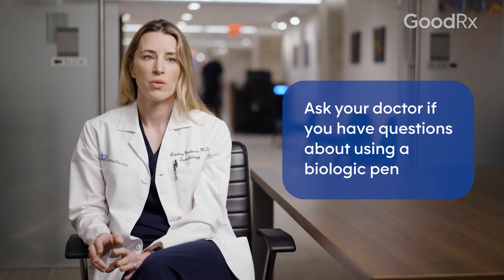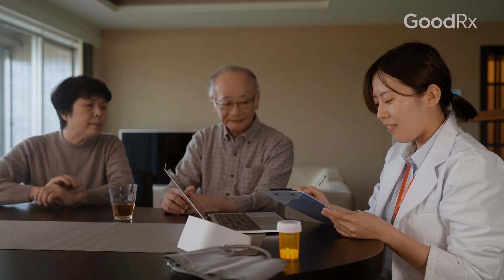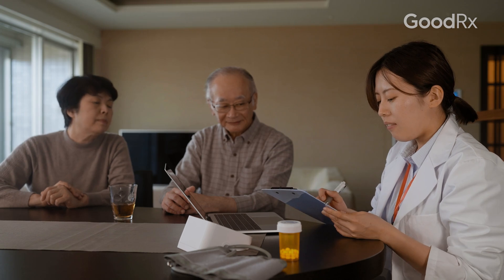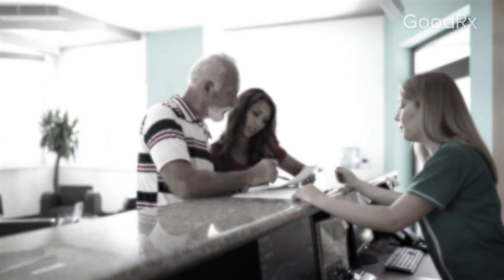If you're not comfortable using an injection pen, what I've told some of my patients to do is come in so I can observe them injecting for the first few injections, and bring a family member because sometimes it's nice to have some support. That way if you have to inject at home and you're still not so sure, you have someone there that can help you.